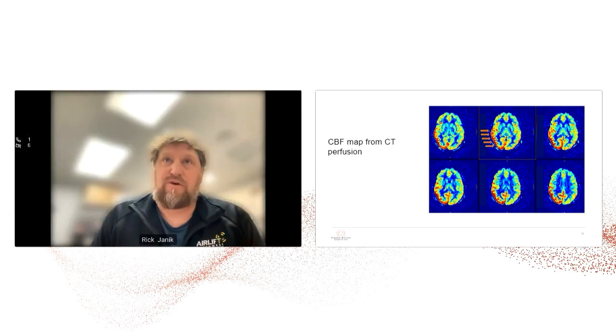Yeah, hi, thanks. I think that the stroke mimic for transfer is probably pretty rare, right? Or stroke mimic or stroke chameleon. But patients that have complications, either from thrombolysis or patients that we are moving to get towards mechanical thrombectomy are common.